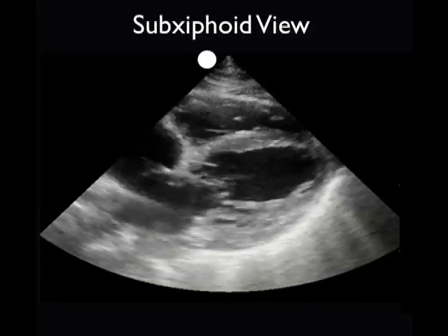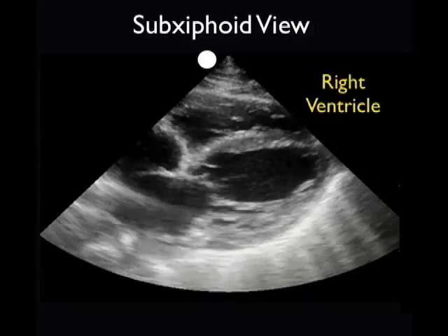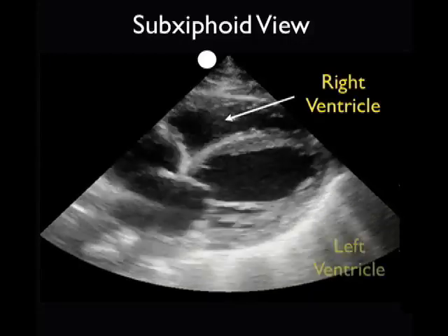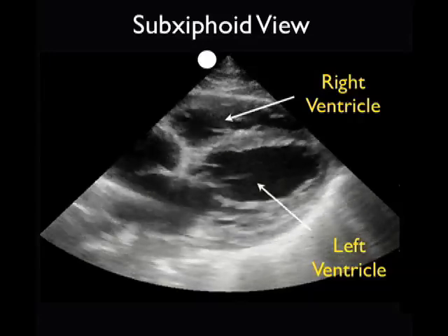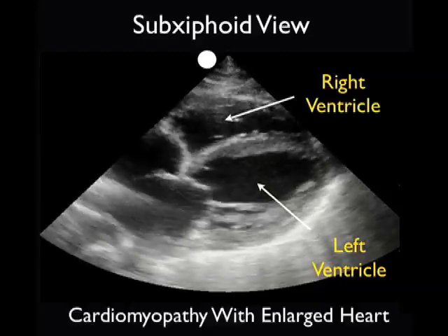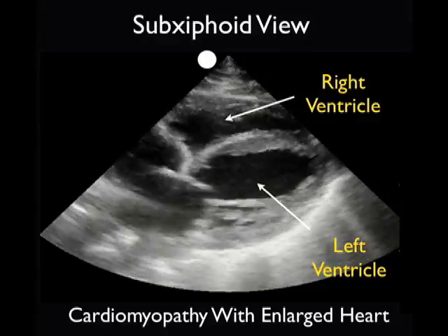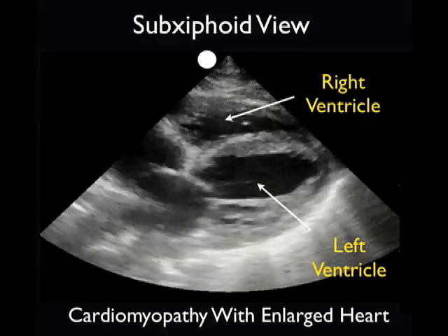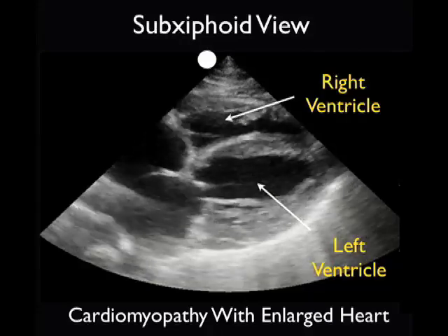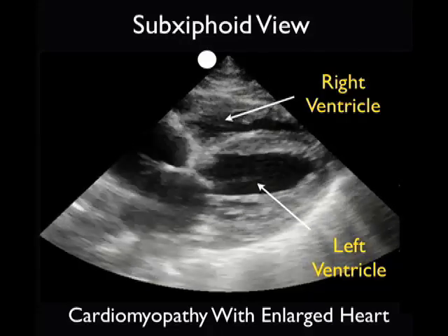In that last clip we noted good contractility of the left ventricle from diastole to systole. Let's contrast that with this clip from a patient who presented with shortness of breath and advanced cardiomyopathy. We see the right ventricle just below the liver, anterior to the left ventricle. What we see here is a poorly contracting and dilated left ventricle consistent with cardiomyopathy. However, note the absence of any significant dark anechoic fluid collections consistent with a pericardial effusion.